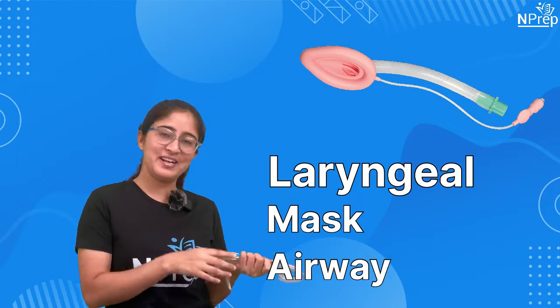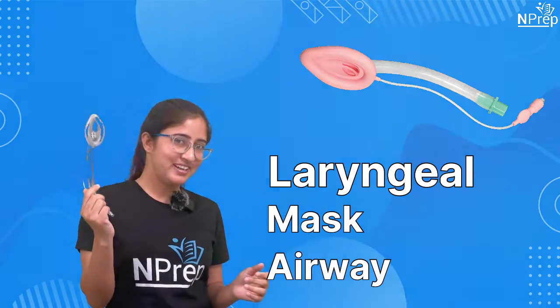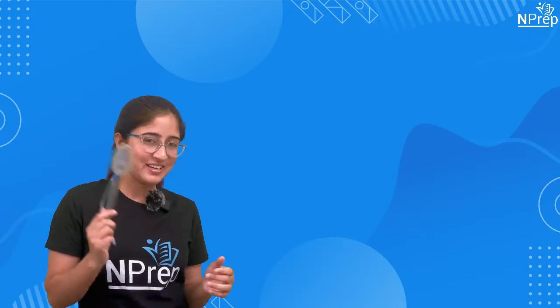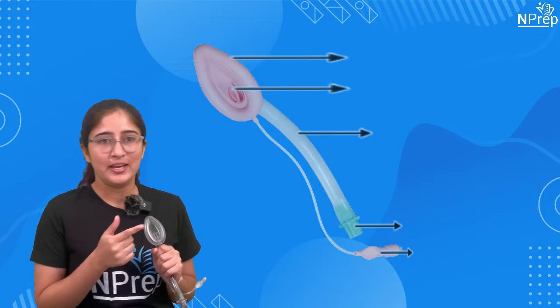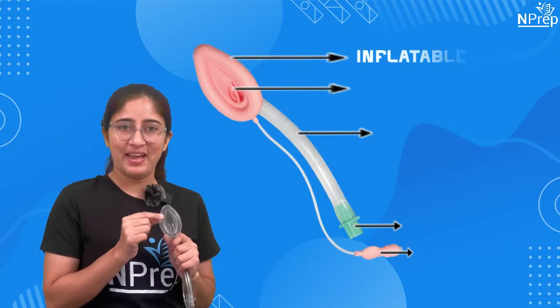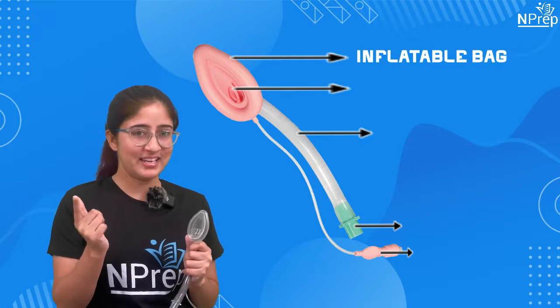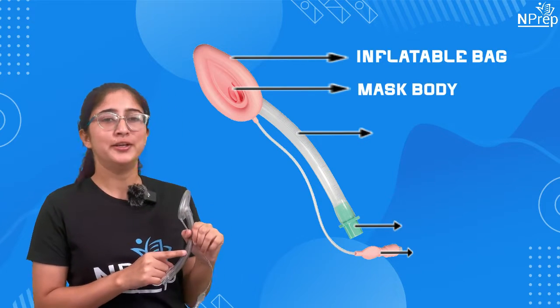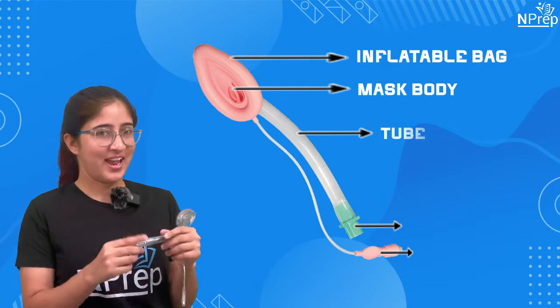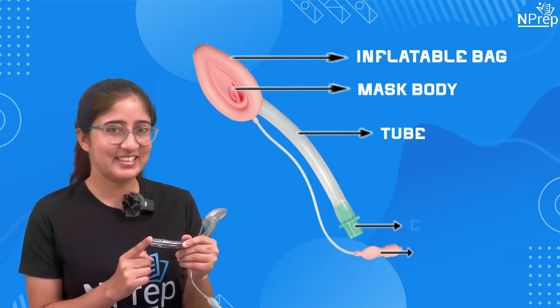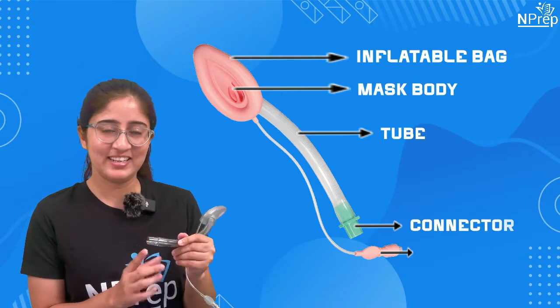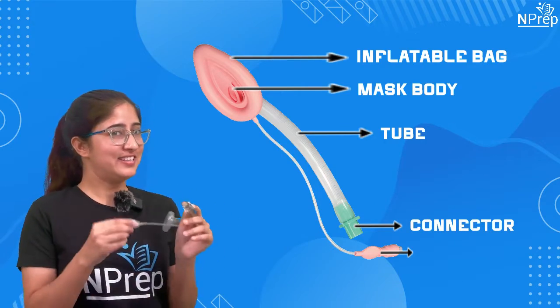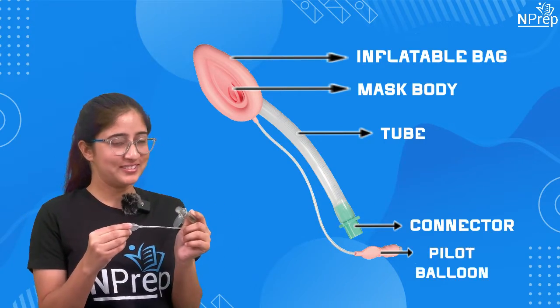Let's learn about its parts. First, inflatable bag. Second, mask body. Third, tube. And lastly, the connector. And this is the pilot balloon.